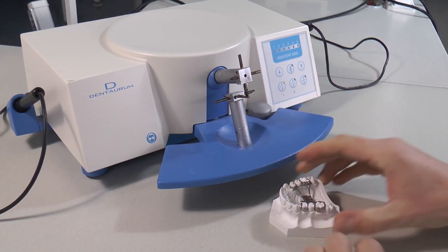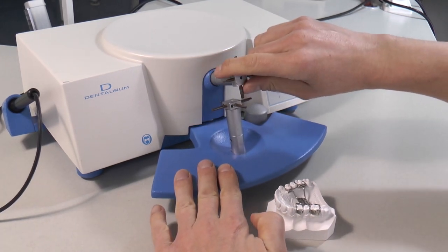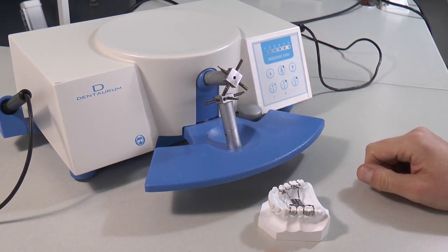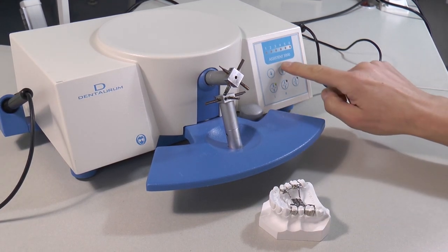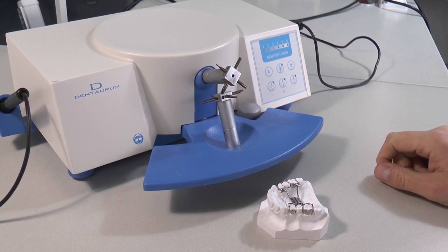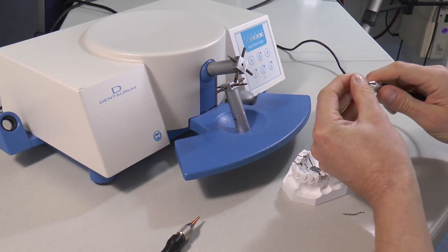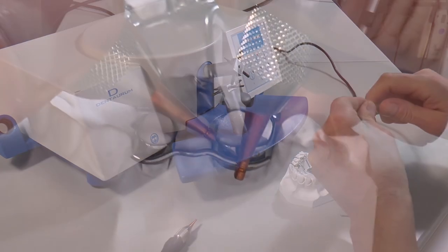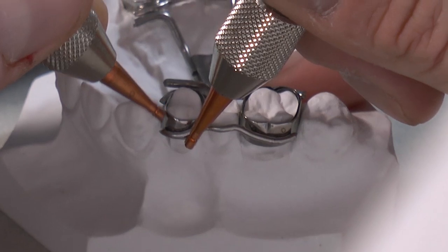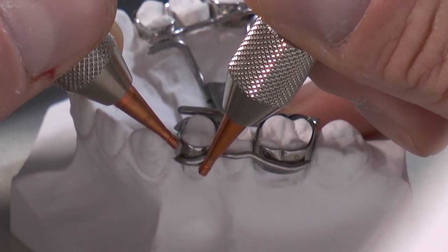Spot welding on a model. First and very important: check if the clickstop electrodes are separated or not. If the upper and lower electrodes have contact, it will take energy from the hand electrodes, so I will turn them to avoid contact. Now switch on the welding mode — to fix the work pieces, three to four is enough. Put the copper electrodes in the hand piece and turn the wing to fix them. Grab the wire with one of the grooves and the tip of the electrode; place the other electrode near the wire on the band to close the electric circuit. Use the foot switch because you need both hands.